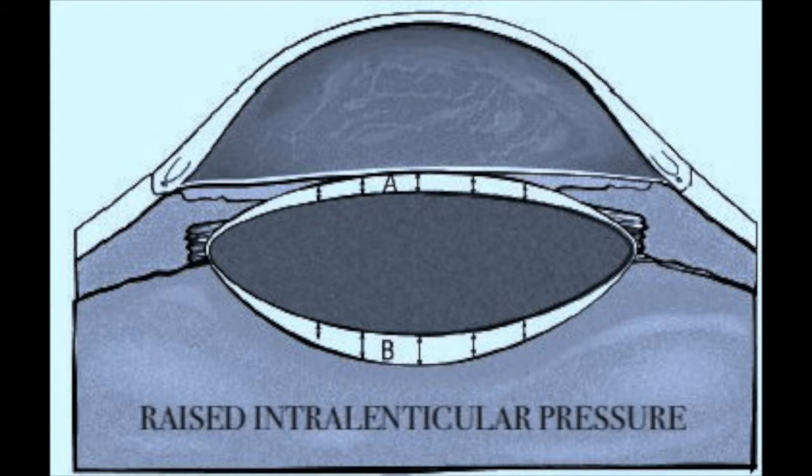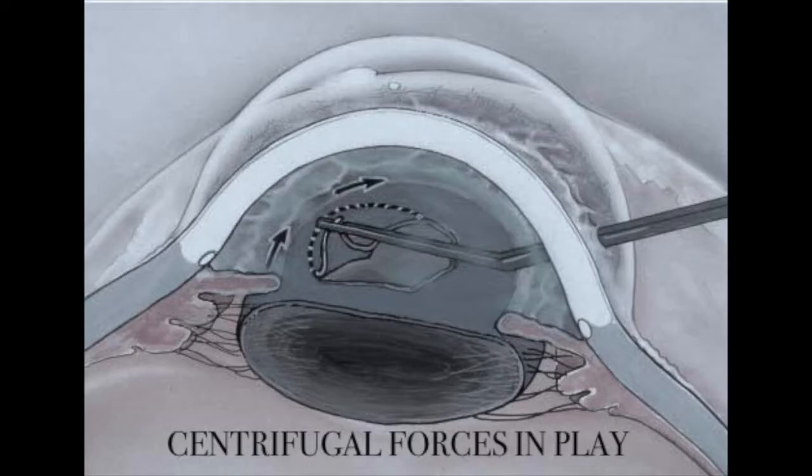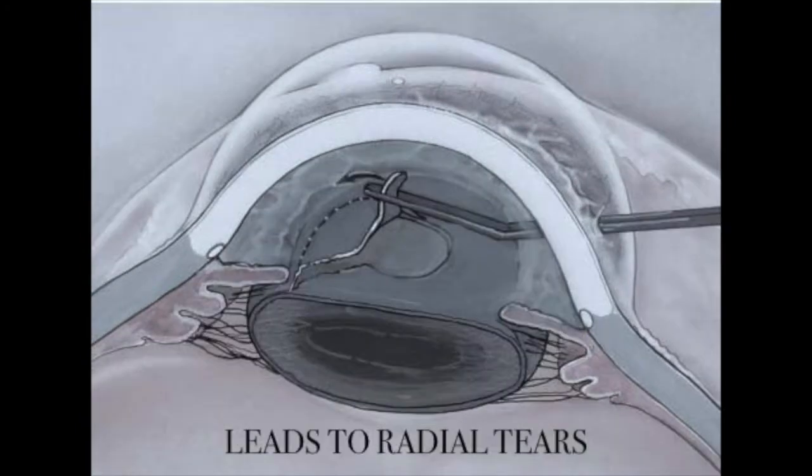In intumescent cataract, there are two pressurized intralenticular compartments, anterior and posterior. Even after aspiration of intralenticular fluid from the anterior compartment, capsulorhexis extension may occur because of increased posterior intralenticular pressure, which pushes the lens upwards. During capsulorhexis, you have to change the vector force from pulling the anterior capsule to lifting a capsular flap.